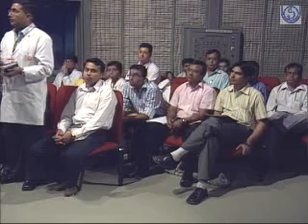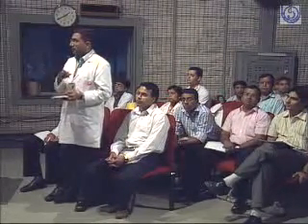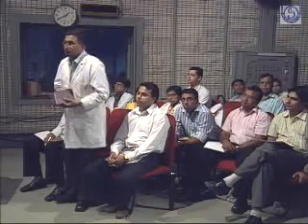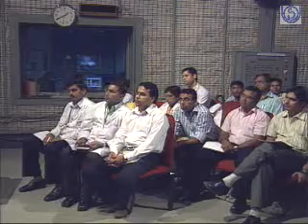For assessing the severity of AR via jet width, how can we calculate this jet width? Directly, LVOT jet. Jet width you just take in a parasternal long axis view. You take the jet width just beyond the aortic valve, in the LVOT, about 5 millimeters from the aortic valve. You take that width of the jet as it comes back into the left ventricle, and at the same point and perpendicularly you take the LVOT dimension.